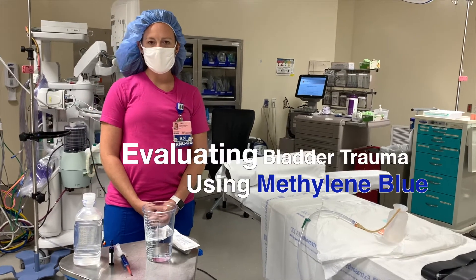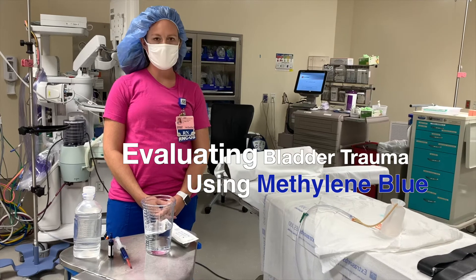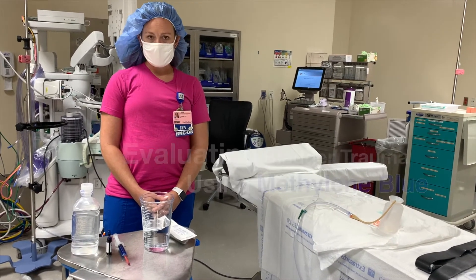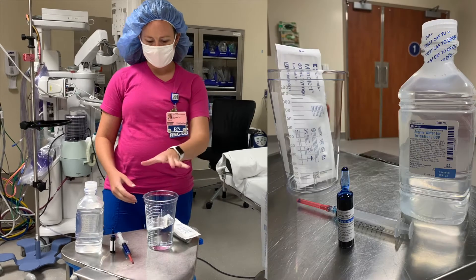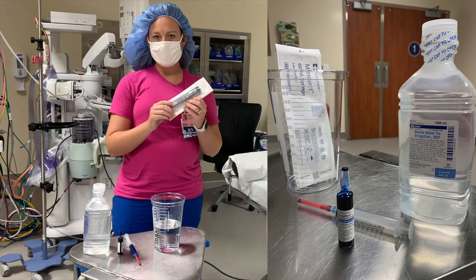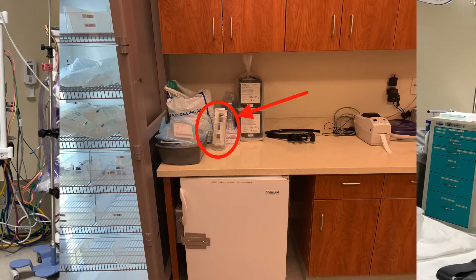Hi ladies, we're going to talk today about the correct way to use 10ml methylene blue dye to evaluate for bladder trauma during a C-section. First you need to gather your supplies: your suction container as well as your 60ml syringe. Those are stocked right by the Pyxis Tower together.